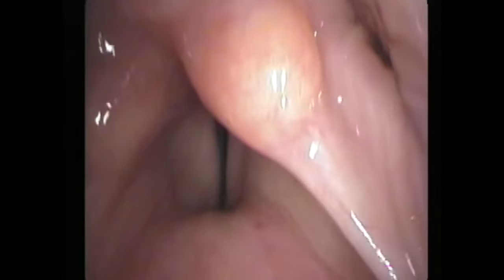And then we watch on expiration to evaluate the lateral cricoarytenoid muscle. In slow motion, you can see that there is almost no rotation of the right vocal process - it slides inward. The left one rotates in and the right one doesn't. And it's super obvious when you put the flexible endoscope in underneath the arytenoids - then you can see the configuration of the posterior commissure and how the lateral cricoarytenoid paresis is the primary cause of the vocal weakness and hoarseness.